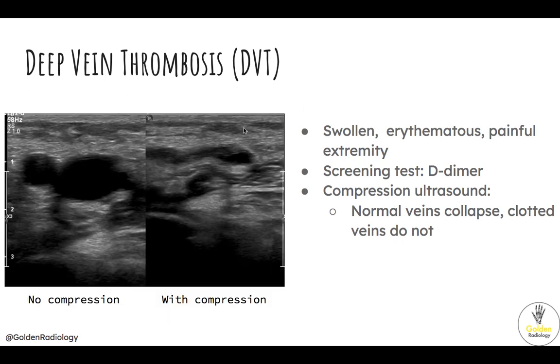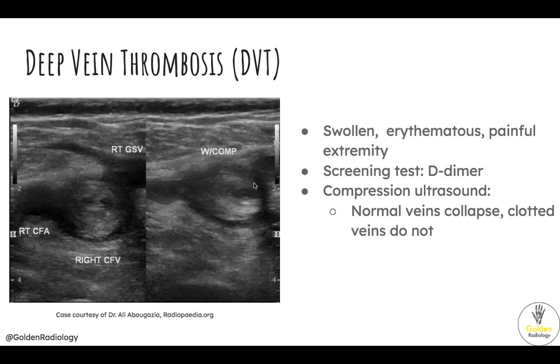Normal veins should collapse with compression, as shown here — here is without compression, and here is with compression. A clotted vein, on the other hand, will not collapse with compression, shown here. We also see this bright clot filling the vein right here.